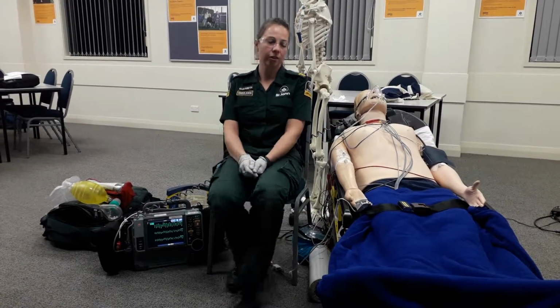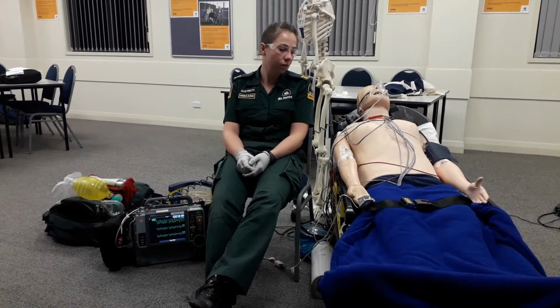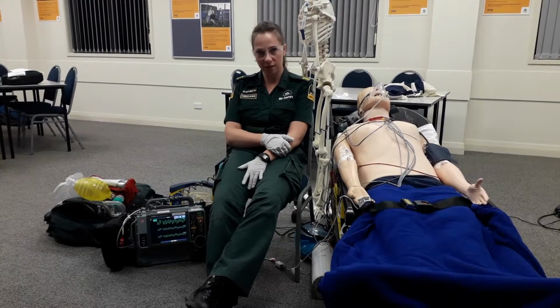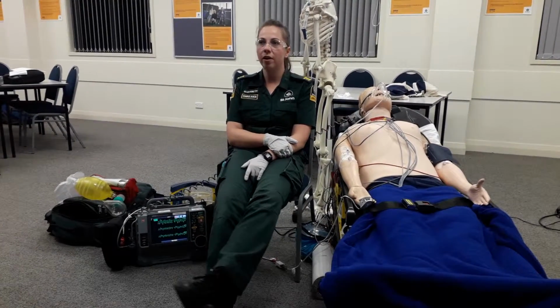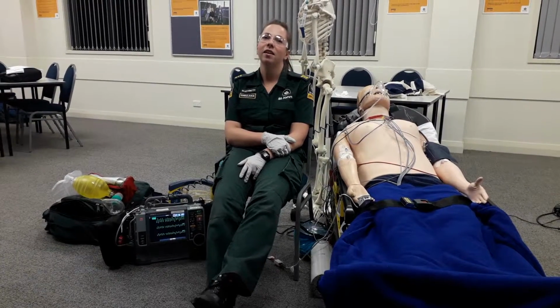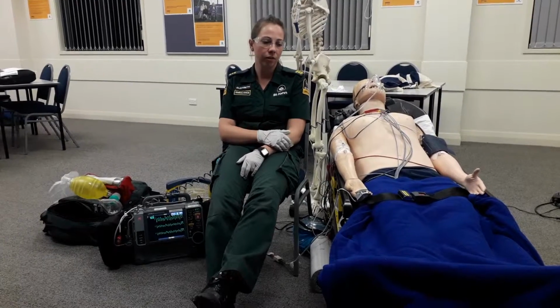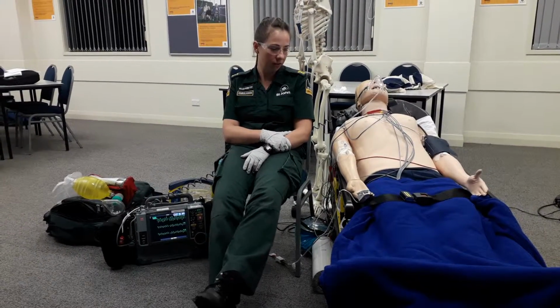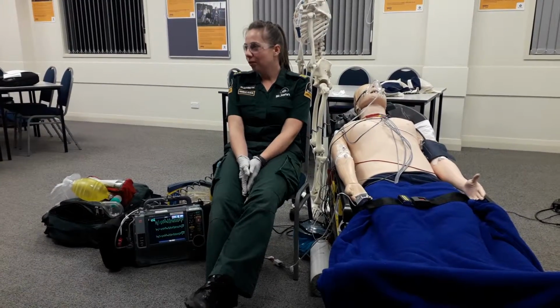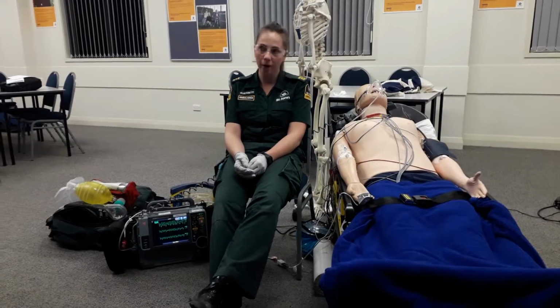Before we consider cardioversion, we need to make sure we don't need analgesia or sedation. Because our patient's not obeying commands, we don't need to consider that today. However, if he was alert, we could call clinical desk and get permission to administer ketamine. In that situation, we obviously have to ask the patient's consent as well. So now, using the challenge and response, I will complete the cardioversion checklist with my crew partner.